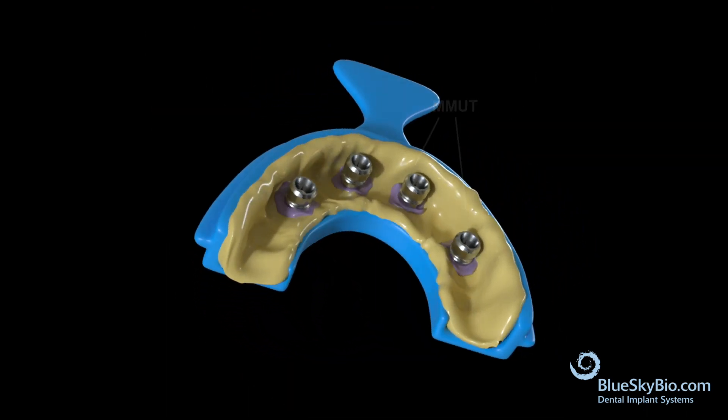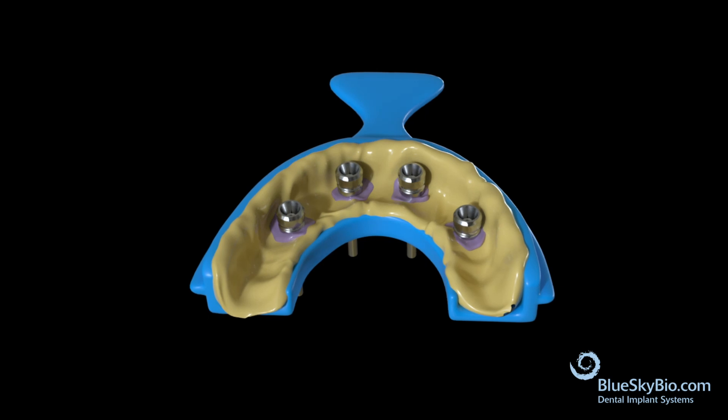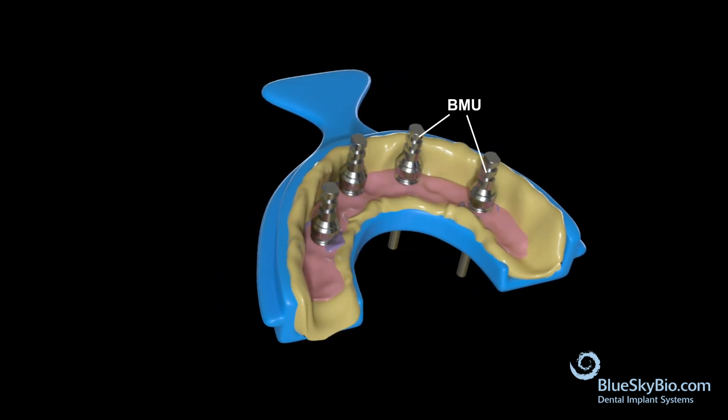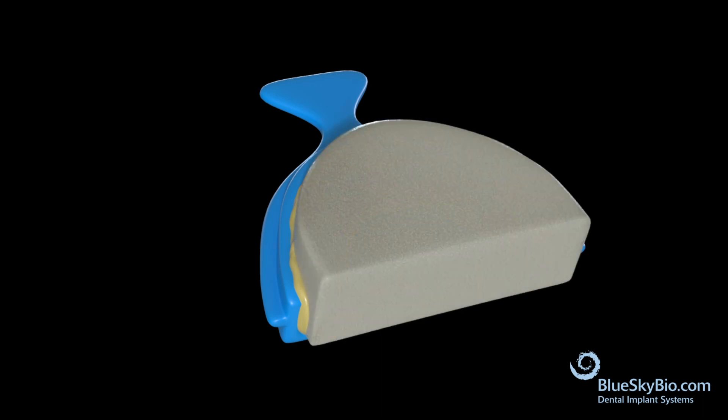The lab will create the master model by attaching multi-unit analogs to the multi-unit impression transfers. The screws should only be finger tight. A soft tissue model should be placed to replicate the soft tissue. Once the soft tissue model is set, the impression should be poured in stone.